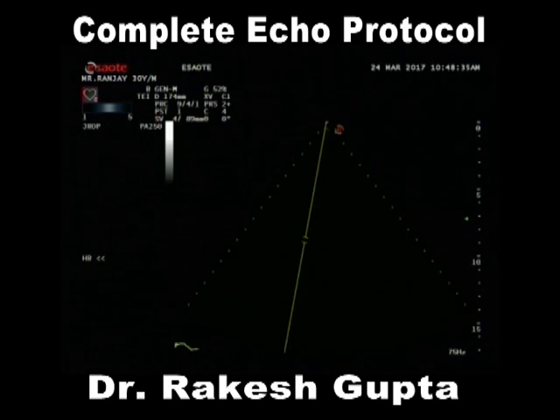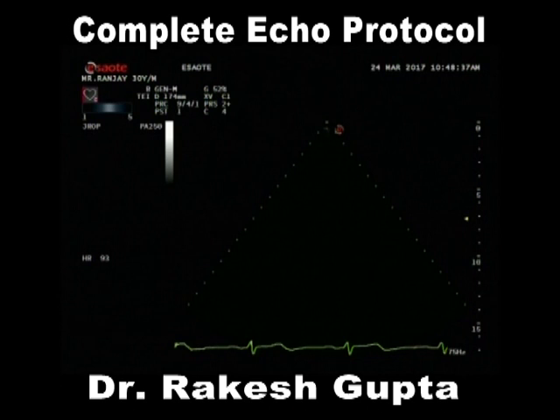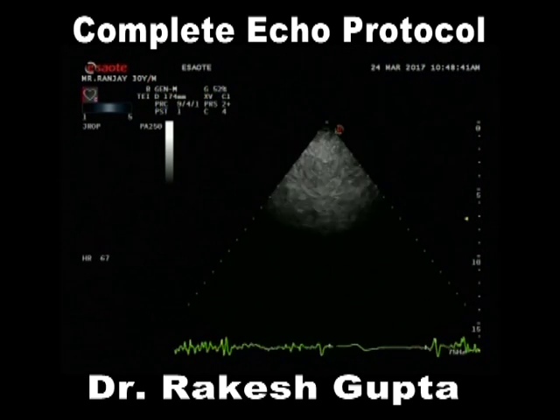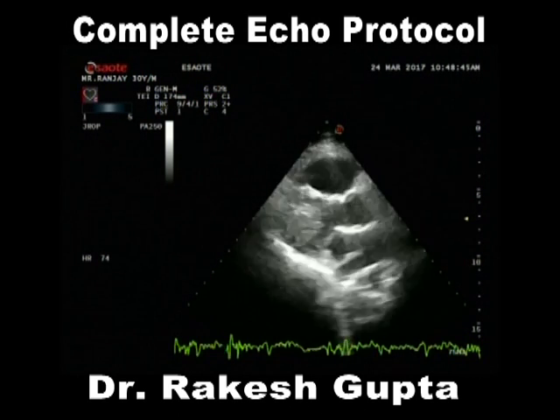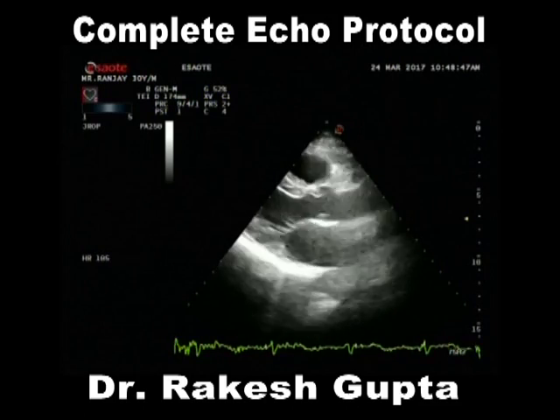Once we have done this, we go back, turn on your side, and now the time comes for a Doppler. Where all should you look for a Doppler now?